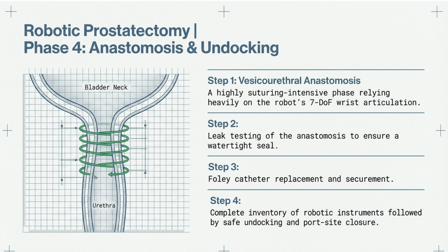The bladder and urethra are reconnected using precise suturing. Leak testing ensures the connection is secure. A Foley catheter is placed to support healing. Final instrument checks and undocking complete the procedure.